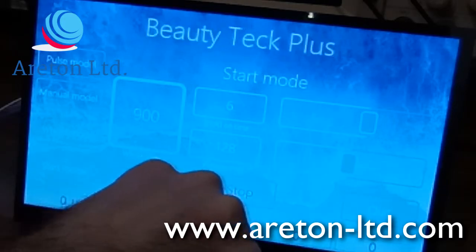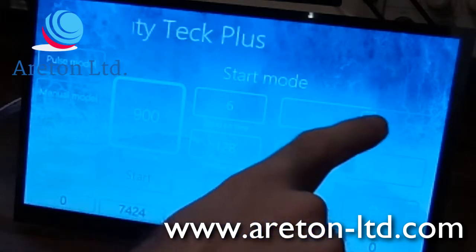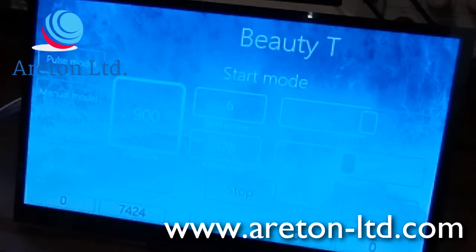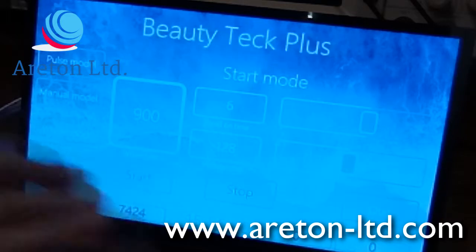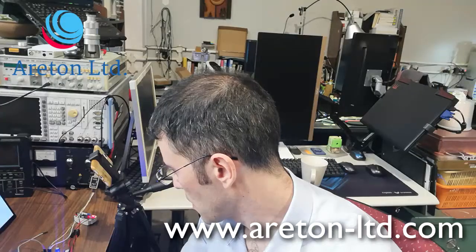So what is happening now, the device is being set up. I'll show you the way we actually set it up. So just see whether I can change that. Then I press start. When I press start, I have to actually hold the handle, which is here. But this is an advanced thing, so we're going to show you this in other videos anyway. So let's forget this for now. But we're going to go and press start. So the device is going to set up, and it should be working.